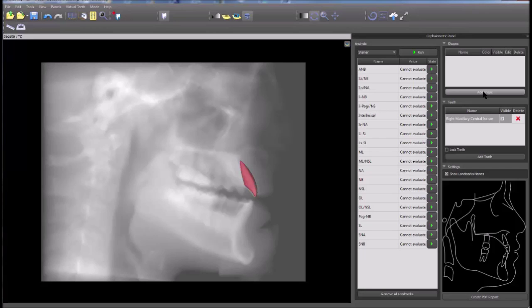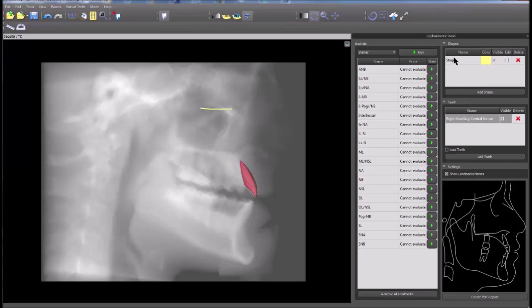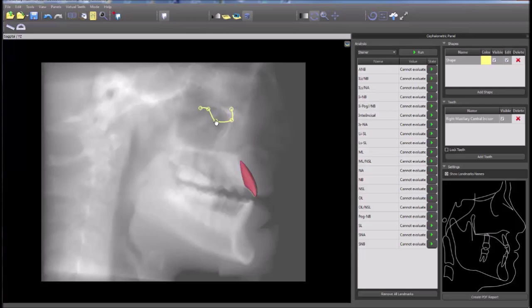Shapes can be added by clicking add shape and clicking on the image. Deselect add shape, highlight the shape name, click edit, and grab the control points in order to edit the shape.